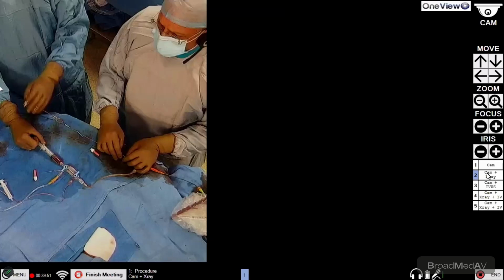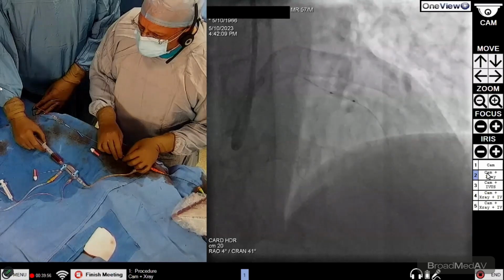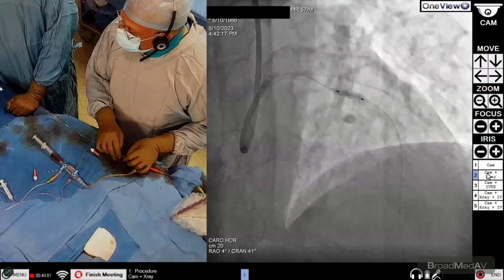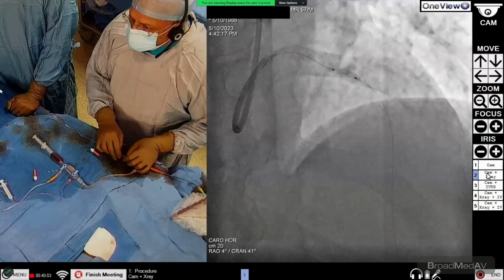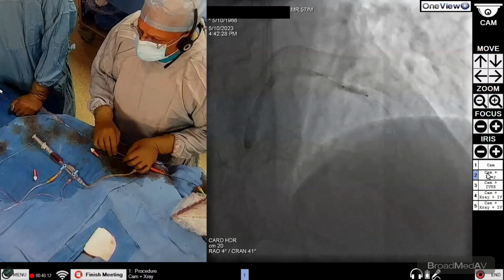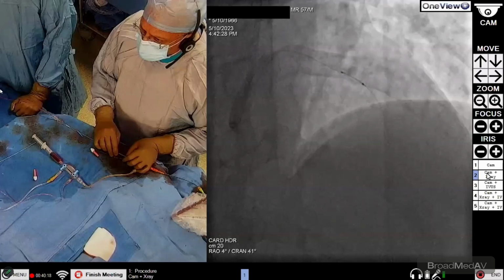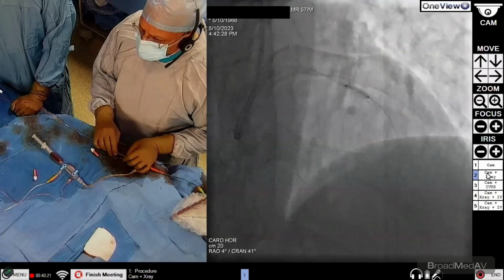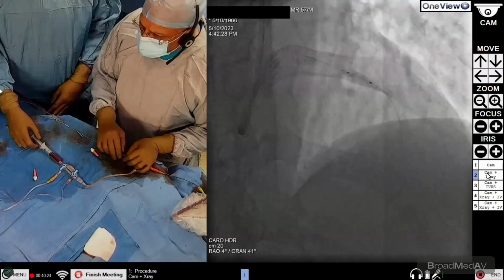Okay, go up. 1, 2, 3, 4, 5, 6, 7, 8, 9, 10, 12. Okay. Yeah. Deflate. Go up. Pressure. 1, 2, 3, 4, 5, 6, 7, 8, 9, 10, 12.